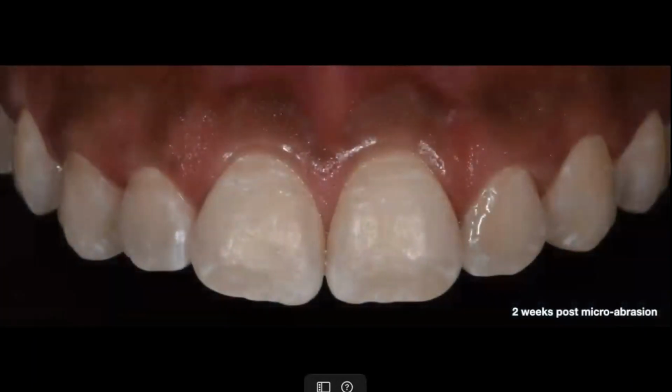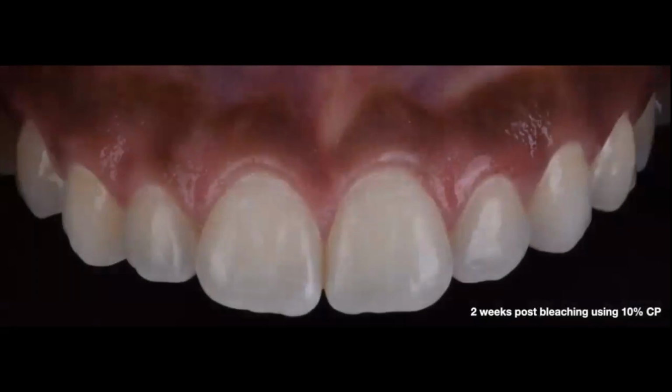This is 2 weeks post microabrasion. As you can see, he still has a little bit of white spots here and there, but we were able to remove, I would say, 80% of the white spots in that incisal third area of the teeth. And after this, we were going to give the patient a bleaching tray with 10% carbamide peroxide. And this is 2 weeks post bleaching using 10% carbamide peroxide.